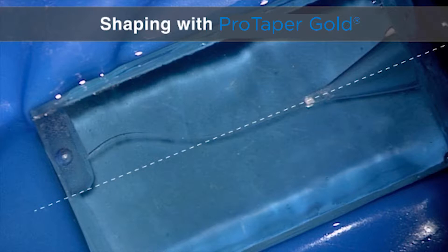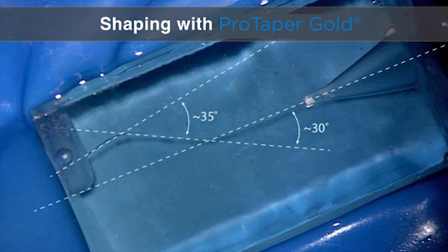If we draw a tangential line to the first curve relative to the straightaway portion of the canal, you can see it forms an angle of about 30 degrees. And if we draw a tangential line to the second curve relative to the first curve, you can see that that's about 35 degrees of recurvature. So it's a good little challenge.